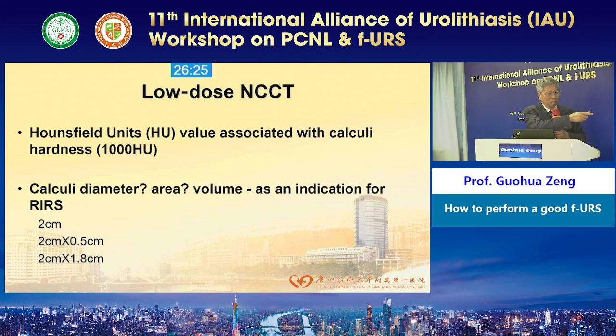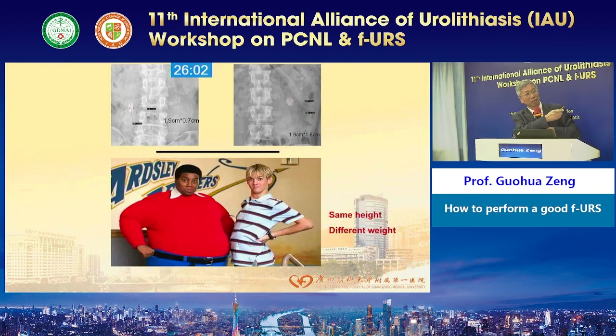For stones less than 2 centimeters, such as this stone: the width is 2 centimeters, the length is 0.5 centimeters, and another is 1.8 centimeters. You see, it is totally different. It is like two people with the same height but different weight.